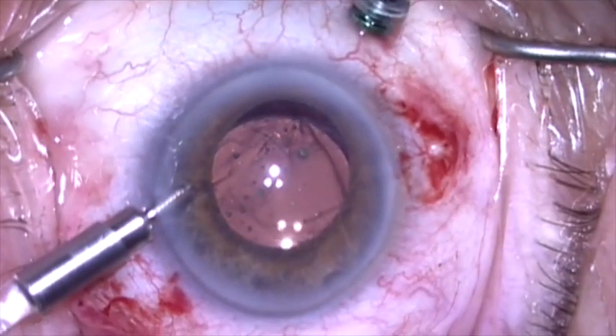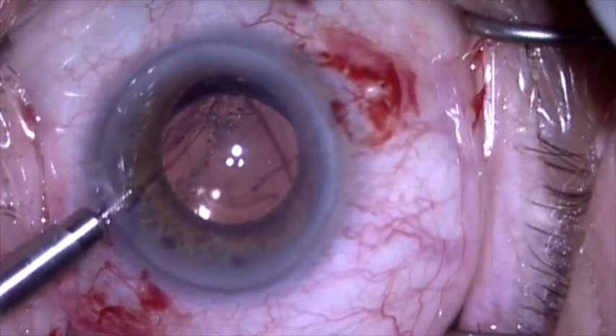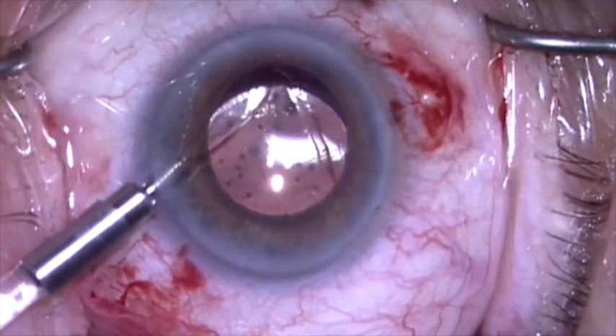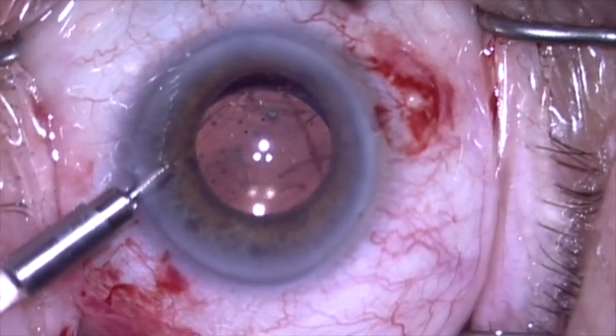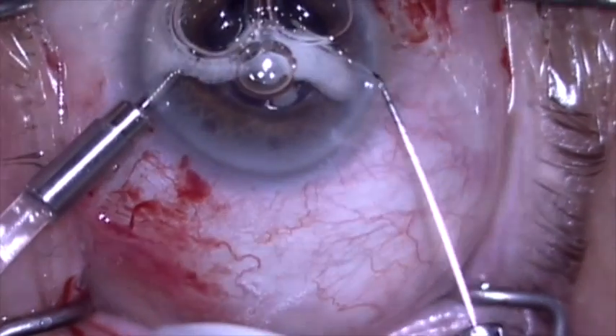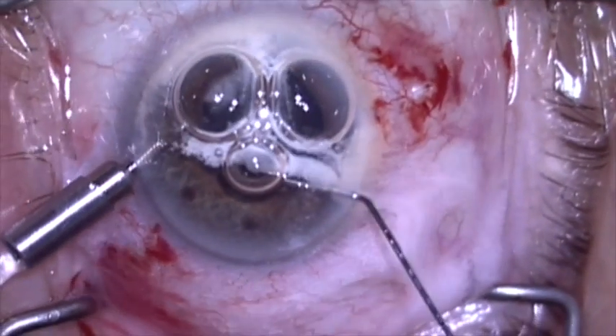With the anterior infusion and the pars plana vitrectomy, this is a very efficient way to remove vitreous from behind the lens-bag complex that might be coming forward.